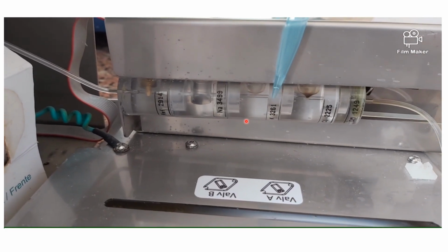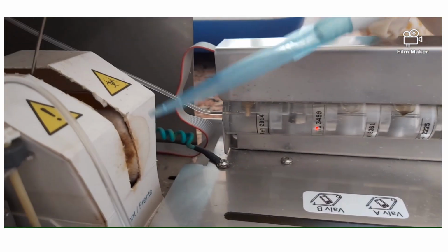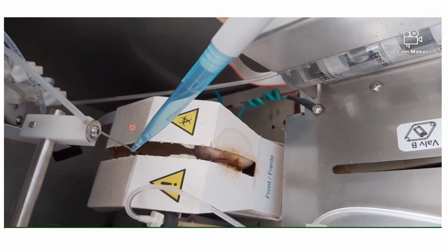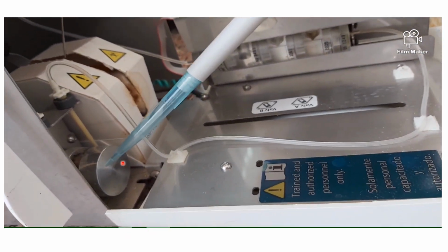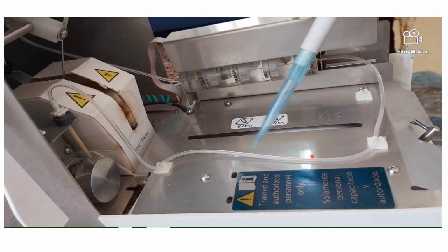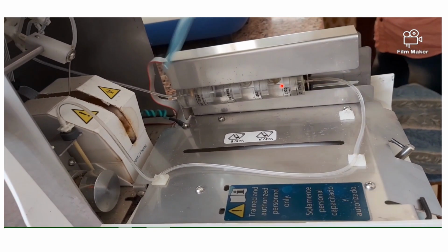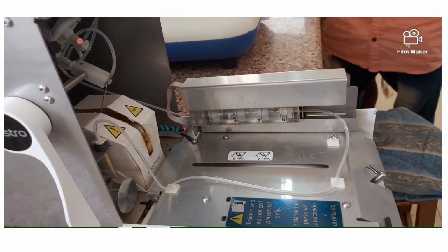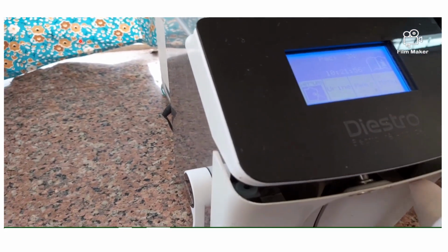Now this is the inside part of the sodium potassium analyzer which has three electrodes: chloride, potassium, sodium, and a reference electrode. This is the stainless steel probe which takes in the sample. This is the rotor through which the tube will deliver the sample to the electrodes. And then there is one more tube which will fill in the standard, with which there will be a comparison.